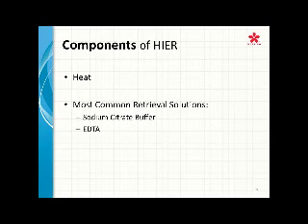But because we're talking about how to retrieve your epitopes, if the tissue is overfixed, it's harder to break down those hydrogen bonds and can lead to false negative and false positive staining. The same applies to underfixed tissue. So just remember that that's what's happening. You have to open your epitopes in order to start the process of immunohistochemistry staining.